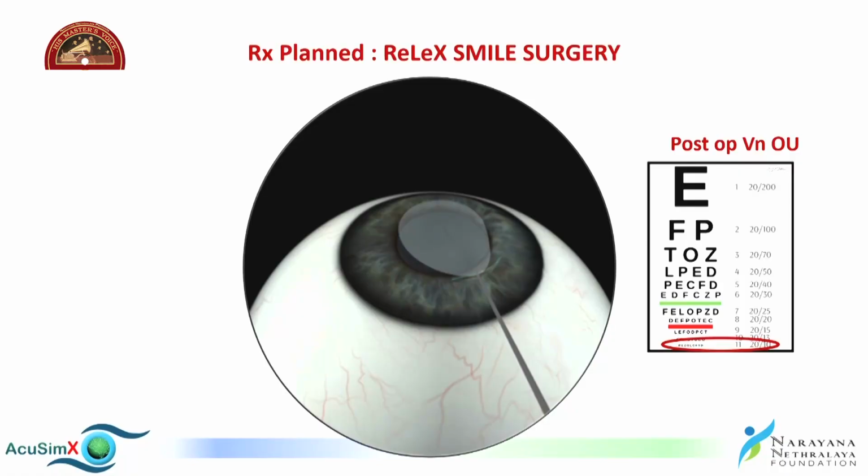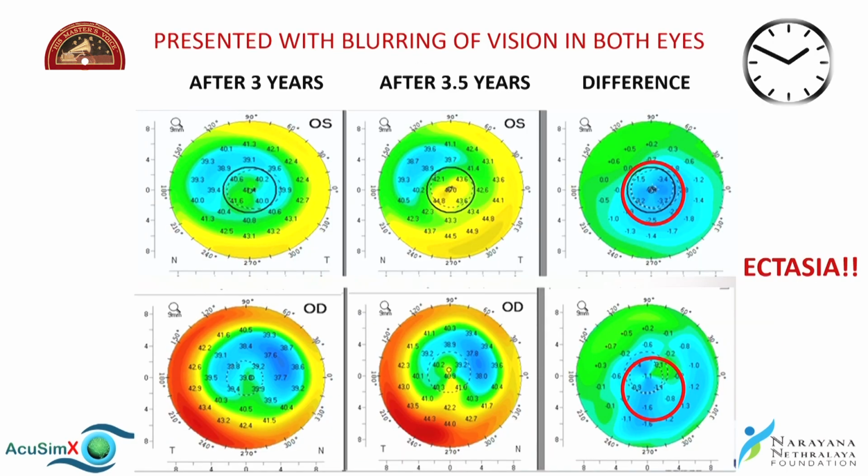Mind you, just look at the refractive error in this patient, it was of the order of -6.5 spherical equivalent in each eye. And though all the indices seemed to indicate that everything was normal with this eye, and SMILE was planned in this patient, and eventually it was performed, the patient did end up having ectasia post-surgery. Okay, so how can we mitigate these issues?